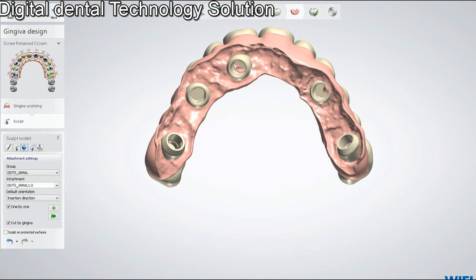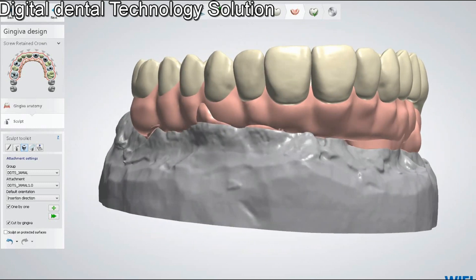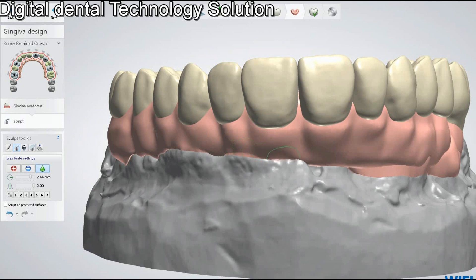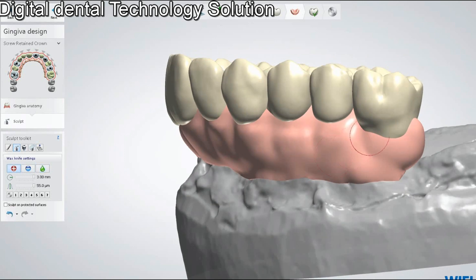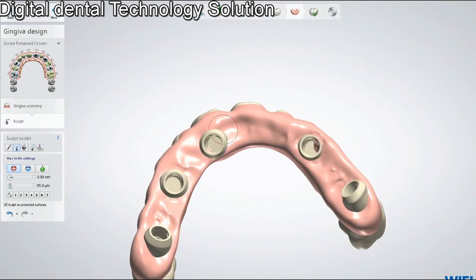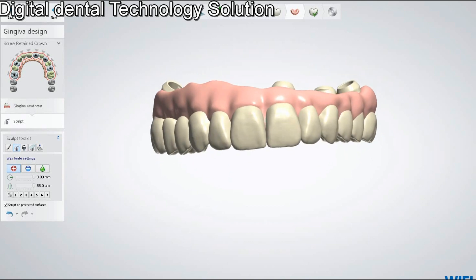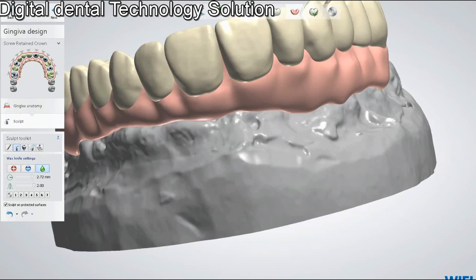Now we will make it a little bit smooth and shape it according to what we want. We can shape it depending on whether we're going to do a cutback or make it full contour for the PMMA — it's all about the restoration type we're going to do.